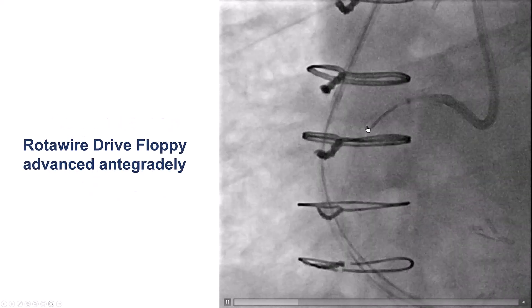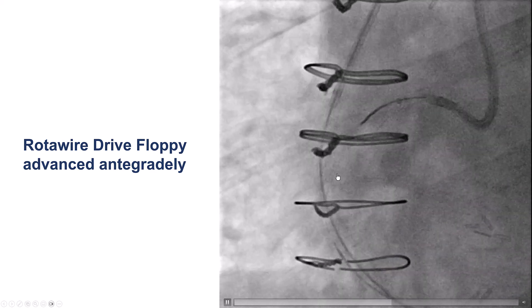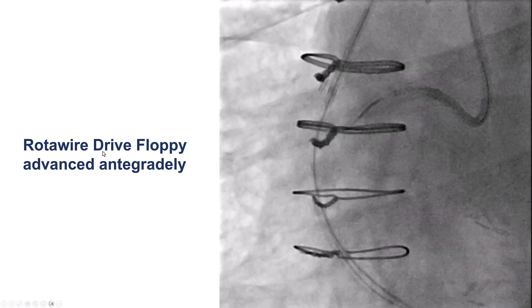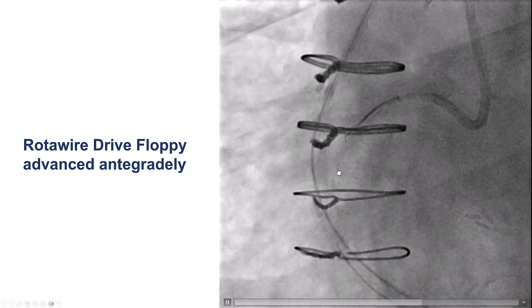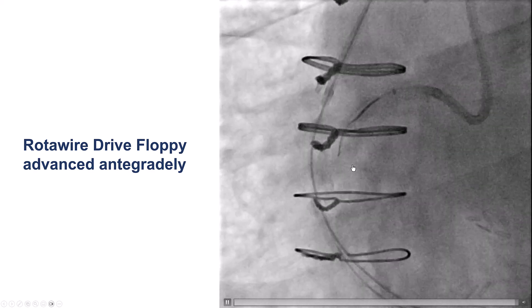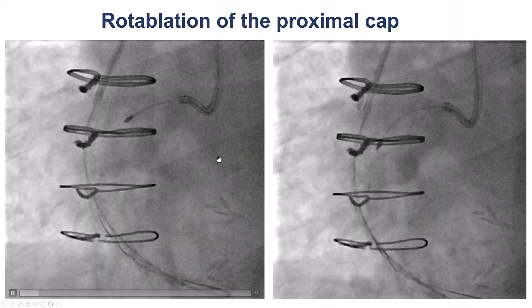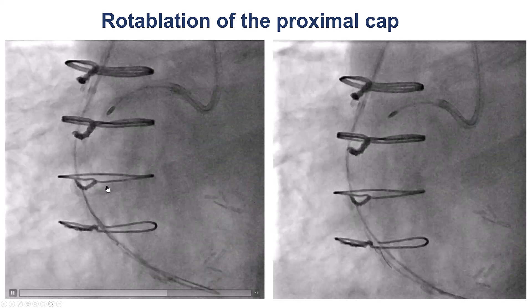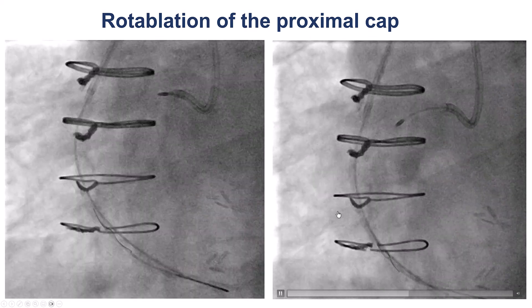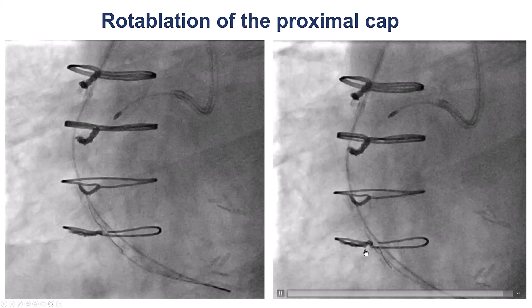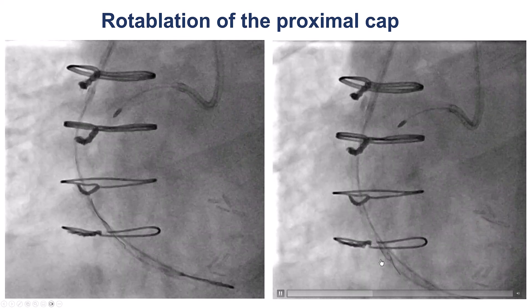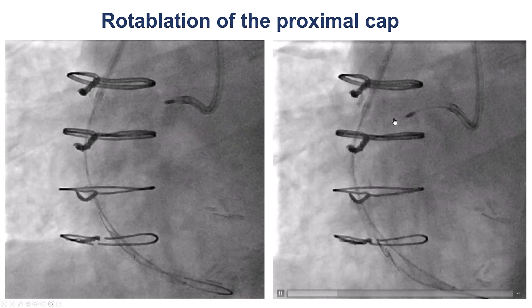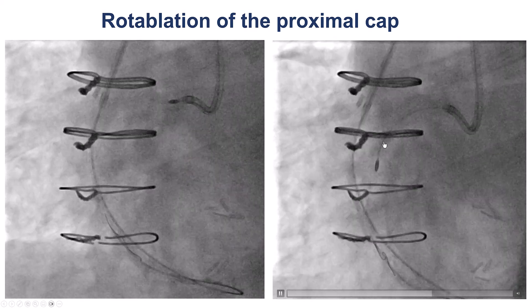The issue was clearly the severe calcium in the mid-RCA, so we decided to wire that segment using a Rotawire Drive Floppy. There was some difficulty, but the wire advanced down to the distal RCA. We then did a few rotablation runs to modify the proximal cap, being careful to stay away from the distal segment where the rotawire is 0.014 versus 0.009 for the rest of the wire. We were able to modify this segment of the right coronary artery.